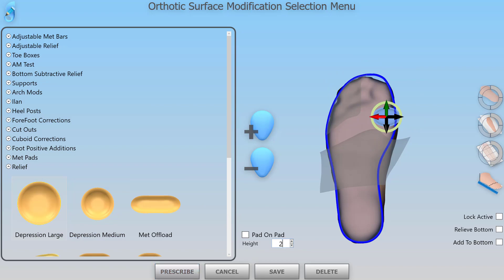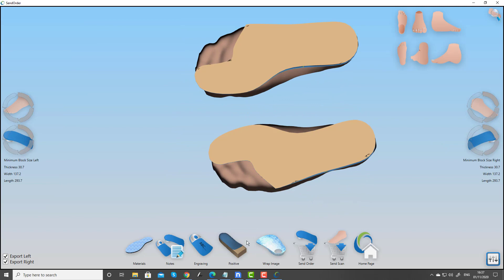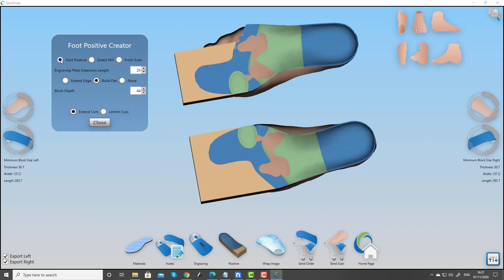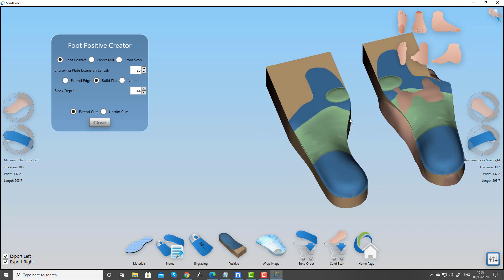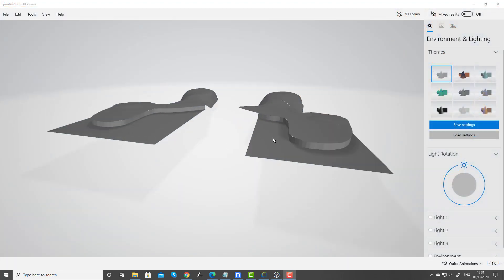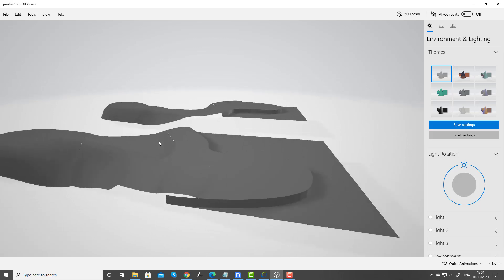In this case here we're overlapping a relief on the forefoot, and we've got a bar that we've added overlapping the boundaries. When we go into our positive tool you will see that all of those features are maintained within the positive mold, and when we export that it will be maintained for machining. So you've got absolute control over all of your shapes.